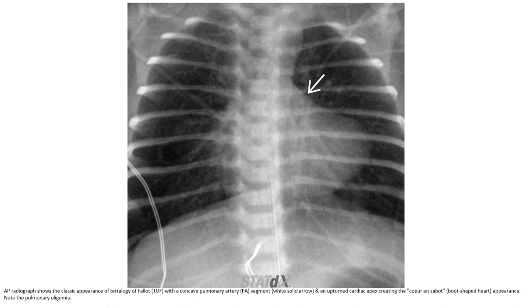This is the AP chest radiograph showing the classic appearance of the boot-shaped heart, with a concave pulmonary artery segment and an upturned cardiac apex, creating the classic coeur en sabot boot-shaped appearance. Note the pulmonary oligemia.